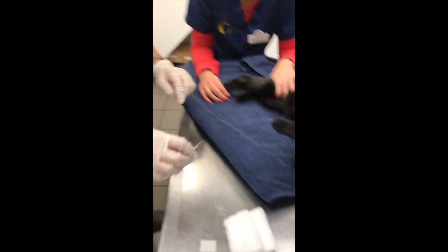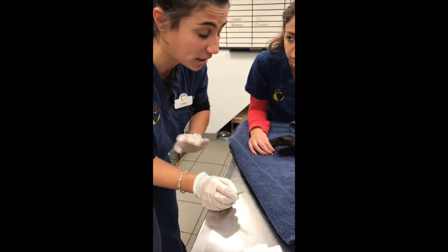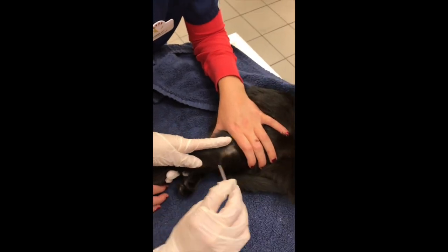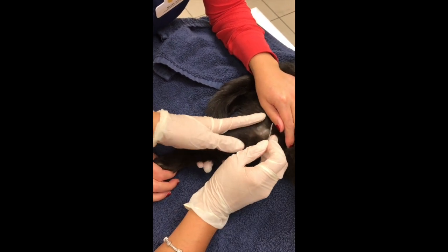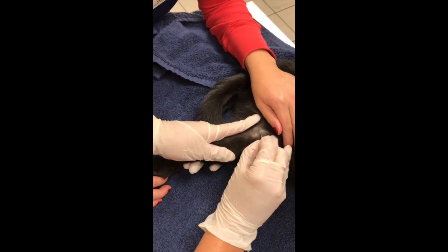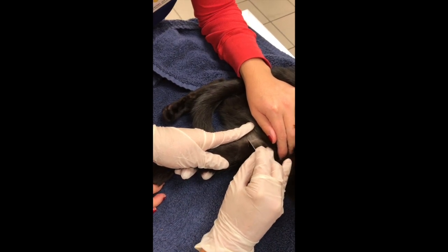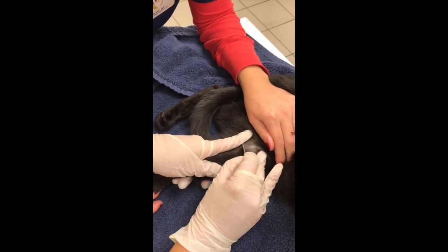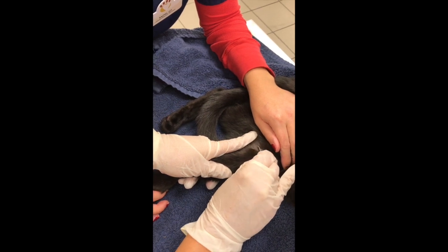Since I'm just doing the surface of his skin, I'm not doing a deep scraping, so I do not need to draw any blood for this. If you want to see here, I am not going at a straight angle like this, I'm going at a curved angle of the skin, and all I'm going to do is scrape nice and gentle just like this. You don't want to go too deep. Like I said before, I do not need to draw any blood. Okay, there we go. That should be more than enough.